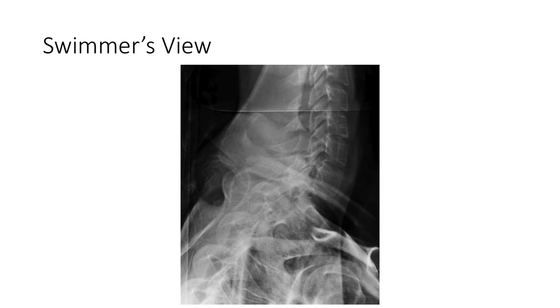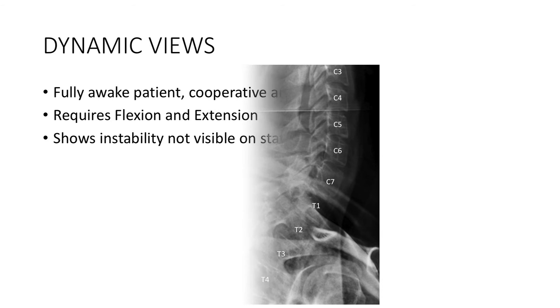When looking at the swimmer's view, we assess coverage and alignment. For coverage, the cervical-thoracic junction should be seen. We check the alignment by carefully matching the corners of each adjacent vertebral body anteriorly and posteriorly.